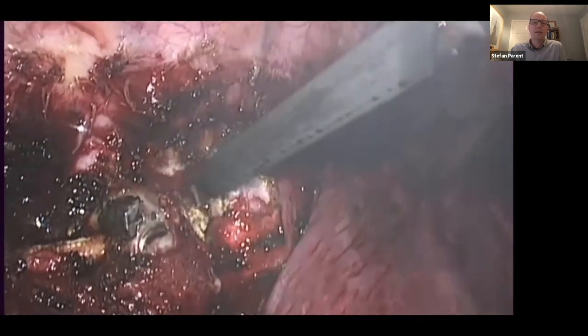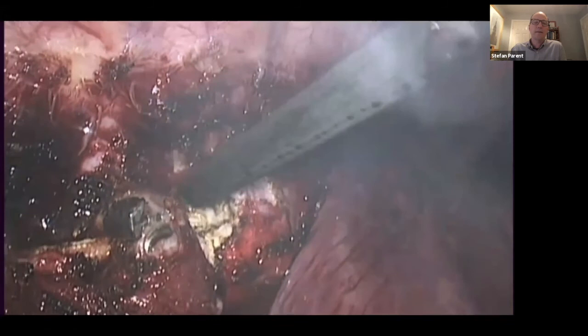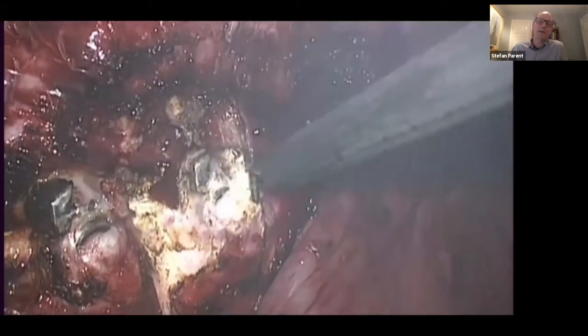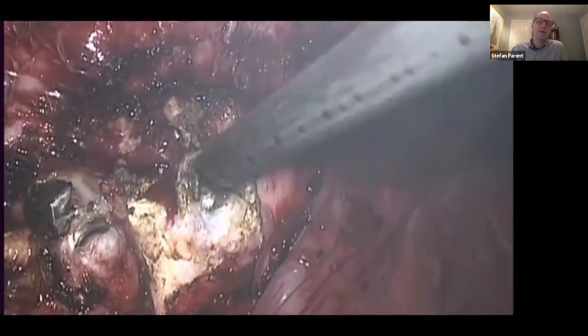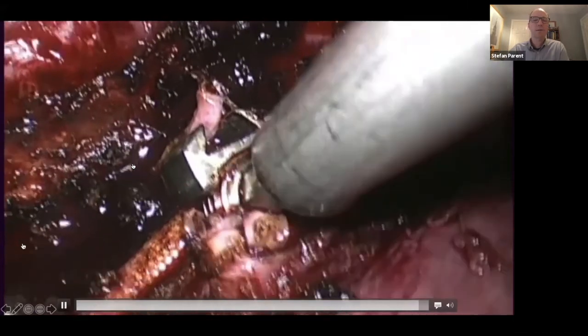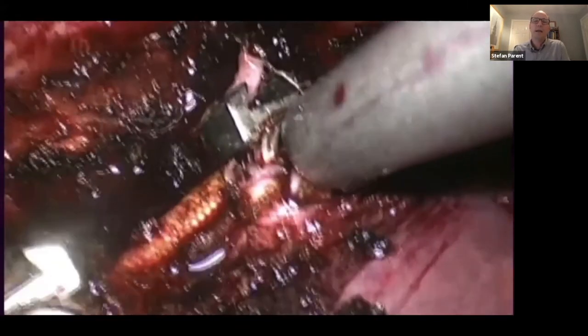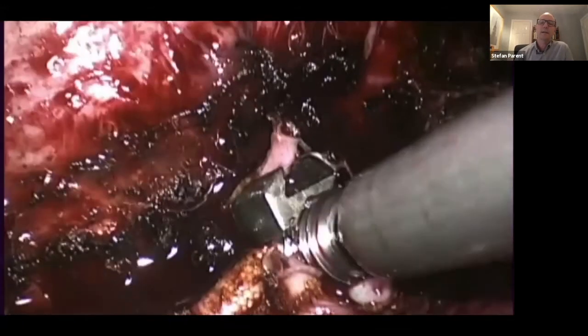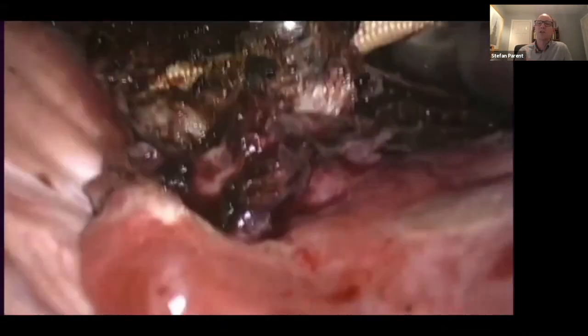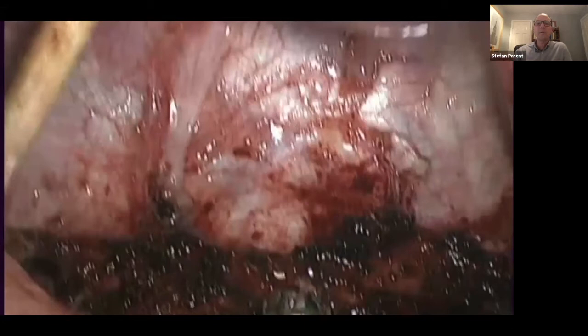The lung doesn't deflate as well, and your assistant needs to be aware. It's a little bit more challenging for the camera and how we do this. So I do all my approaches myself. My fellows or my residents typically help me out with the camera. It's usually a 2-person job. So it's important. Then you have your set screw. You take it off, and sometimes you'll see that the tether is broken underneath it. Sometimes it's not. Sometimes it's just at the junction. And then make sure that you're completely removing or unlodging this tether before you pull on it, and then you can remove it.